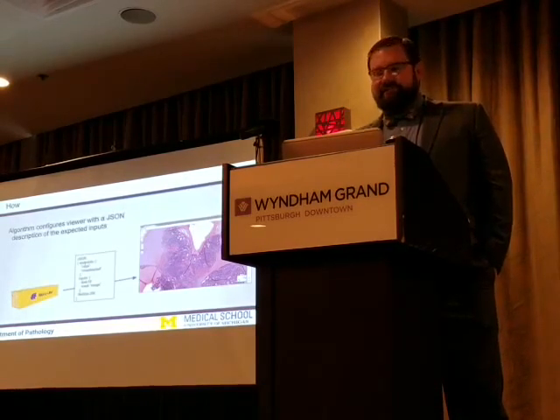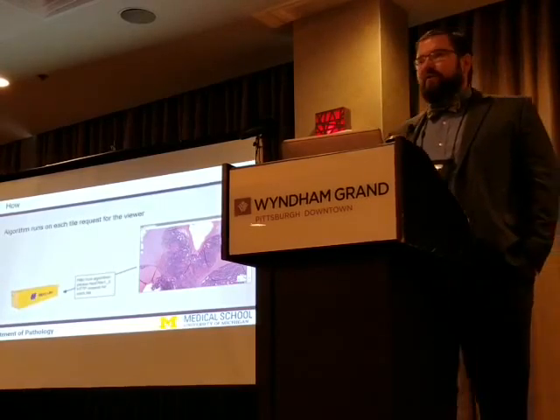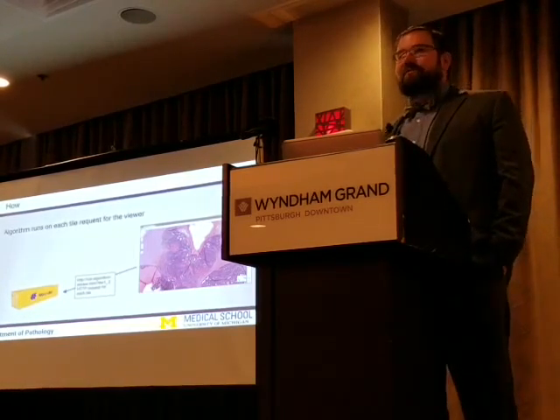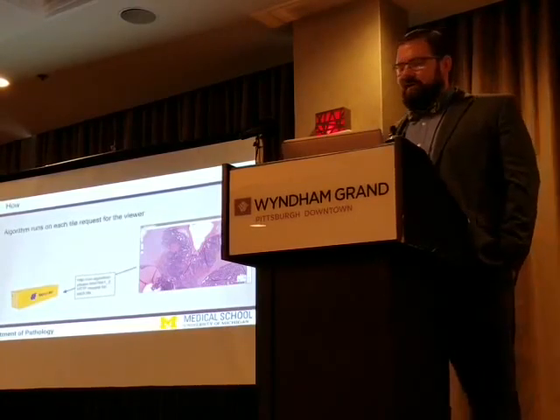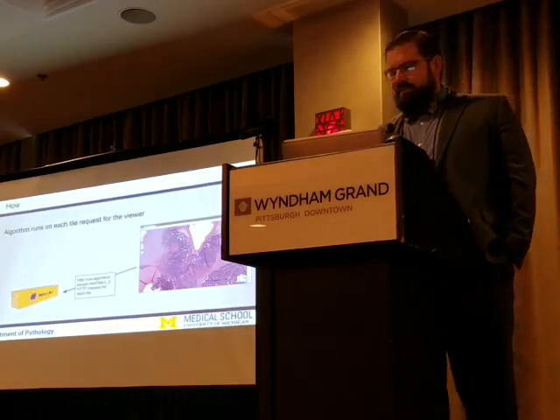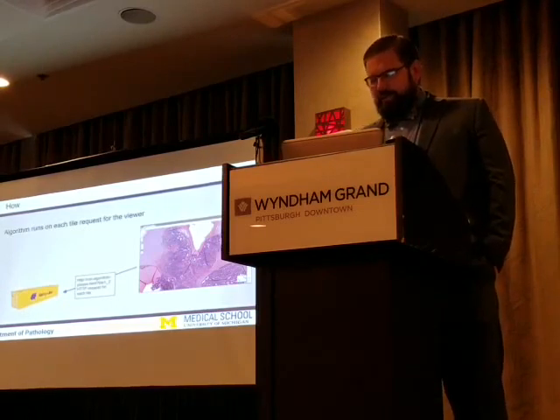Once the configuration is complete, as the viewer is requesting tiles, it also sends a request to the algorithm with the name of the whole slide image that is currently being viewed, the location of the tile, and what the user parameters are, and the algorithm now has enough information to actually process the tile and return the results.